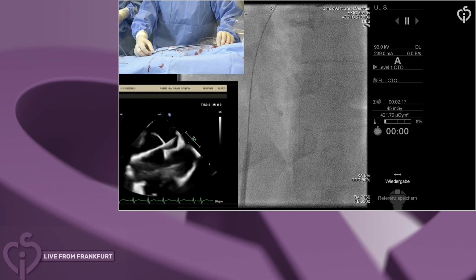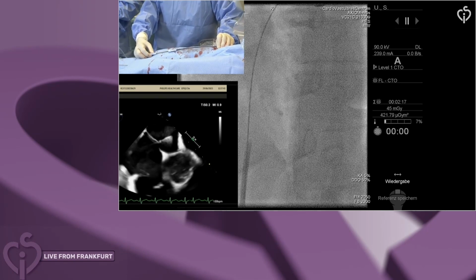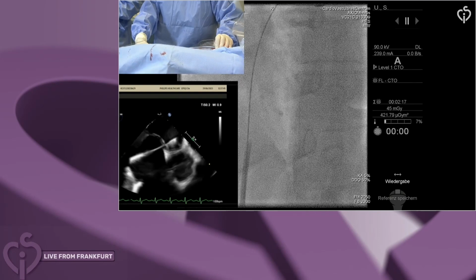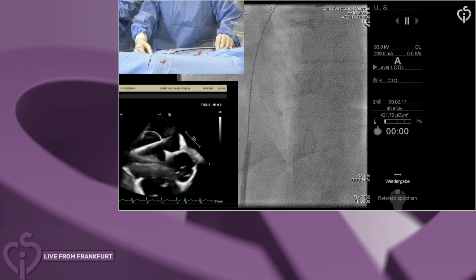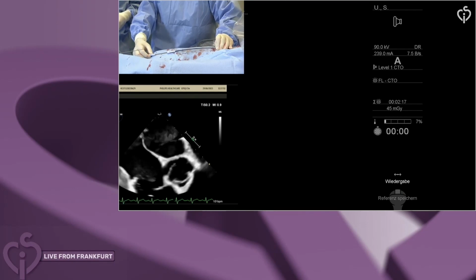Ready? So Busha won here in this case. Yeah. It's not a fight. So, Horst, are you trying to see the length of the tunnel, the purpose of angiography? What do you see typically when you inject?